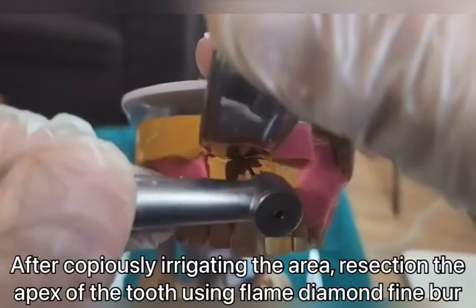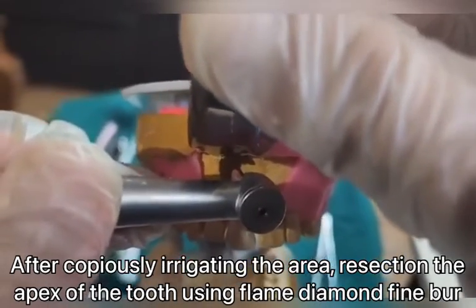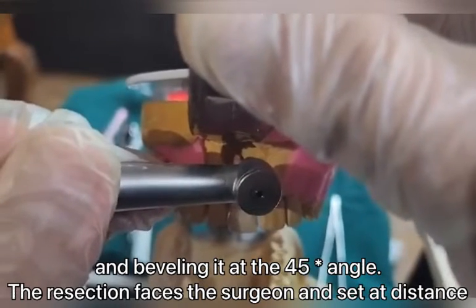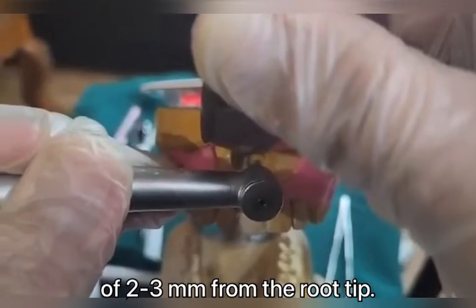After copiously irrigating the area, resect the apex of the tooth using a flame diamond fine burr and beveling it at a 45-degree angle. The resection faces the surgeon and is at a distance of 2 to 3 millimeters from the root tip.